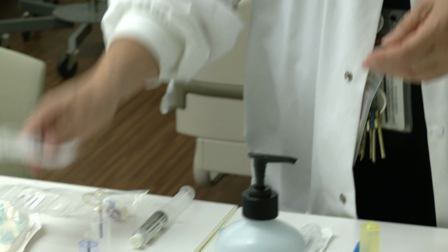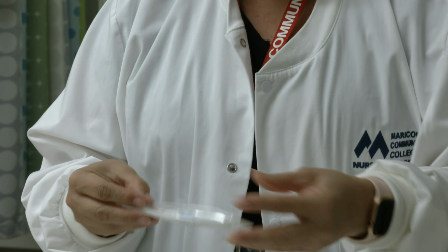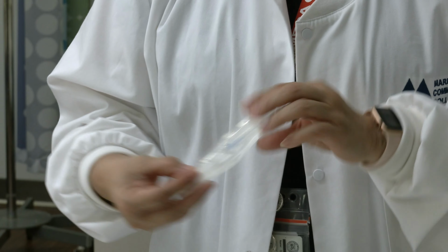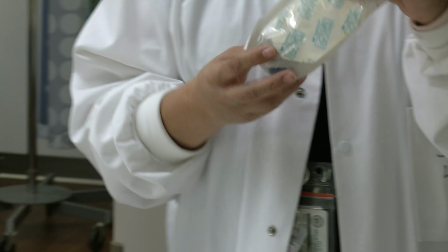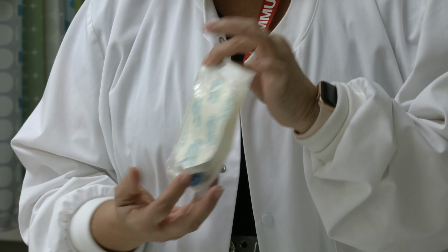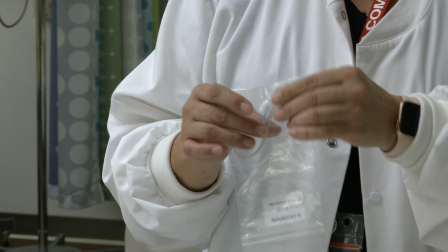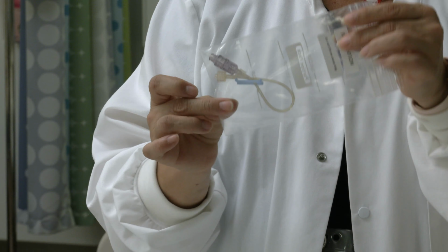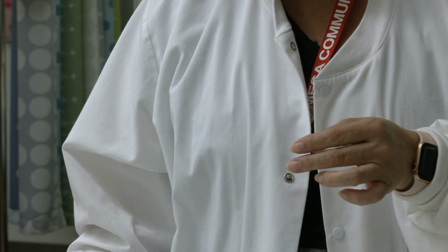We also have IV catheters because very commonly what will happen is that we will put in the IV and then we're going to draw blood from it. So we're going to make sure that you guys kind of go over that, which requires an IV start kit as well. If we're going to start an IV, we always have to make sure that we have it locked. And so this is the extension set that you get with your IV kit. That will be in your bag as well.